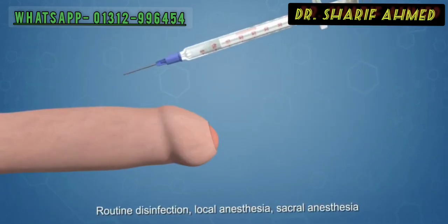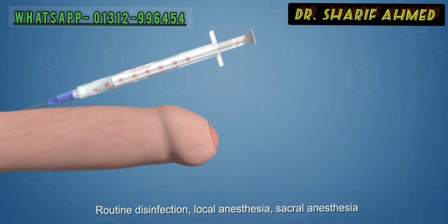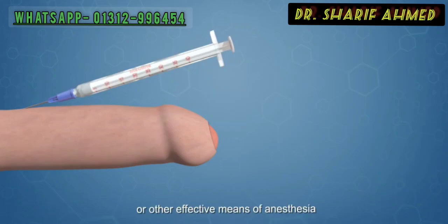Routine disinfection, local anesthesia, sacral anesthesia, or other effective means of anesthesia.